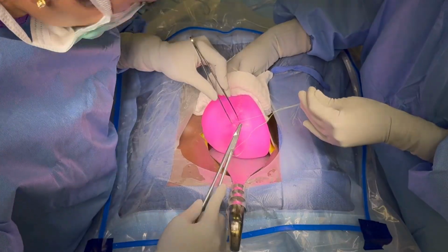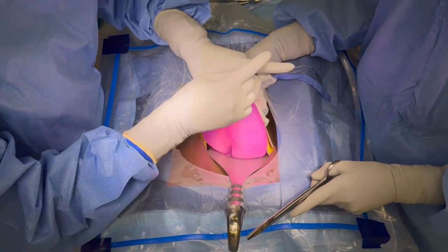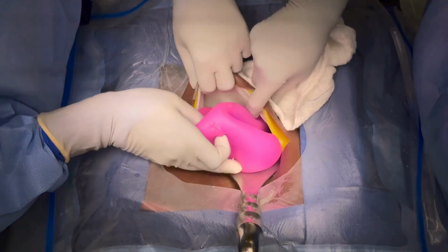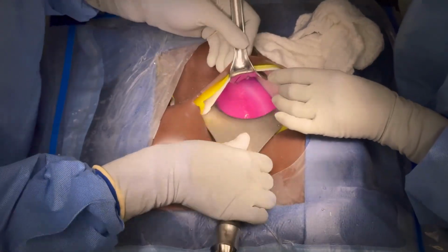Once past the inferior apex of the hysterotomy site, the suture is then tied and cut. The uterus is then replaced into the abdominal cavity, and the bladder blade and Richardson retractor are then removed.